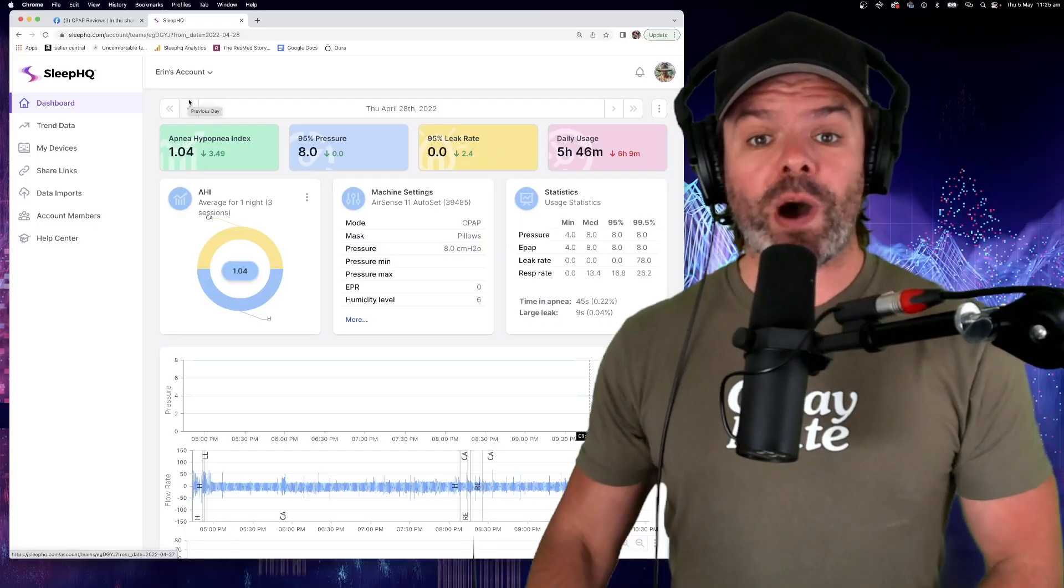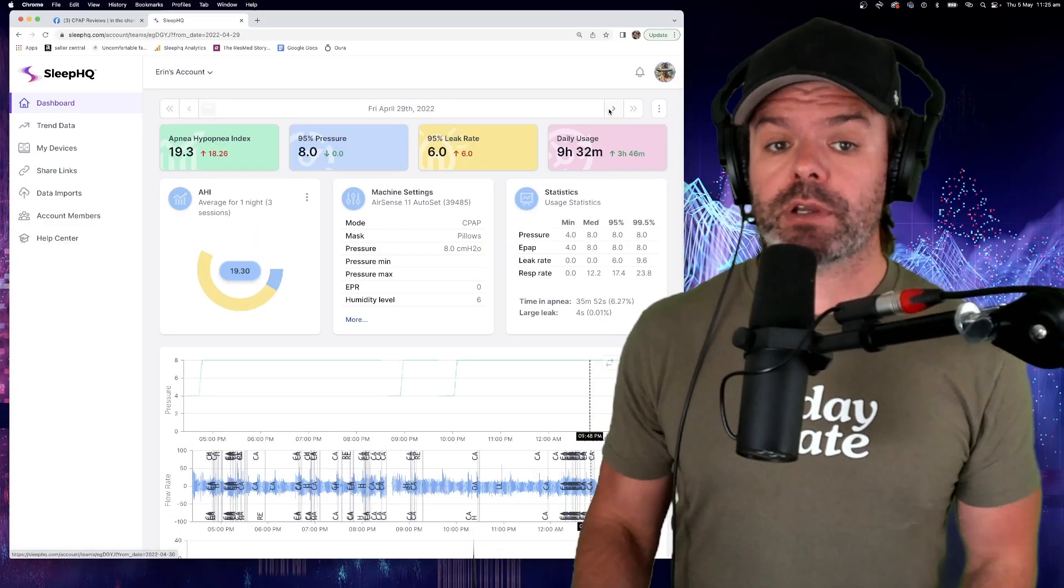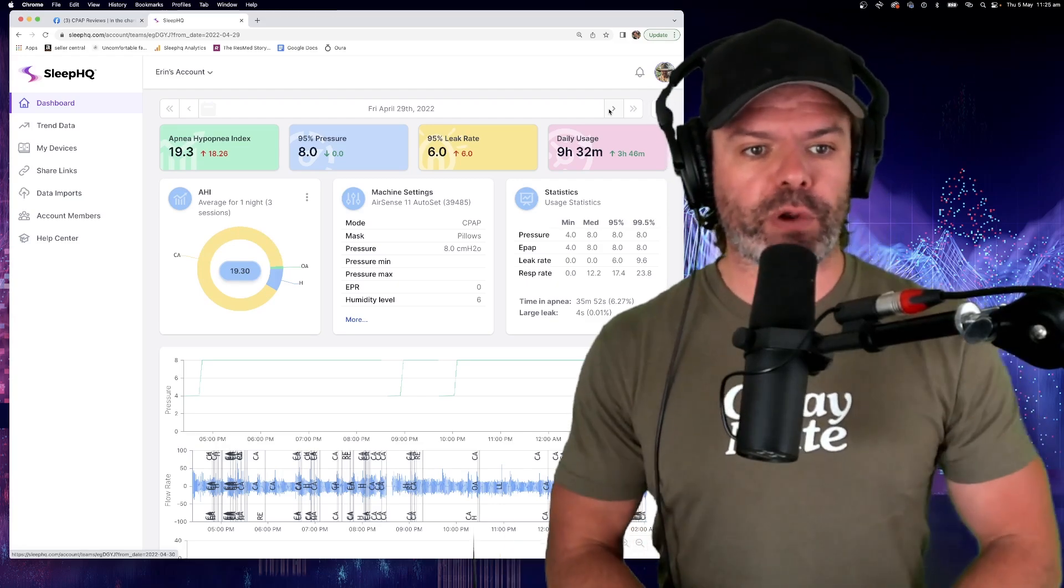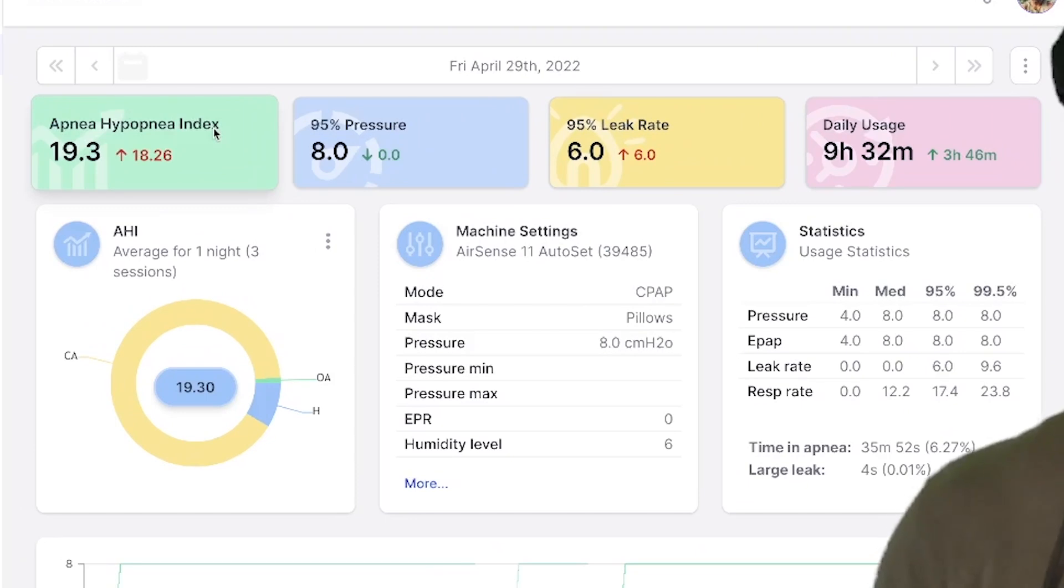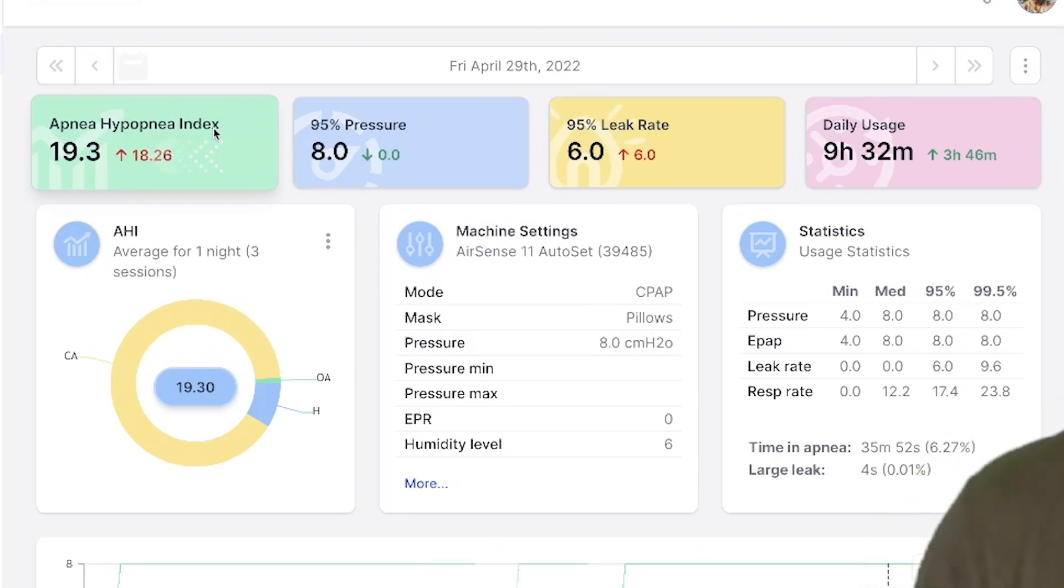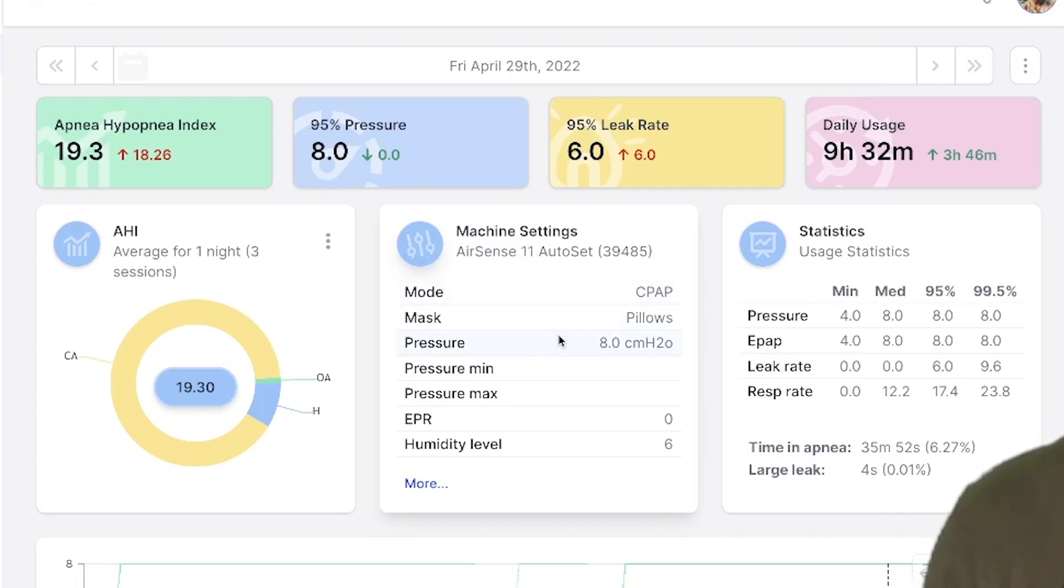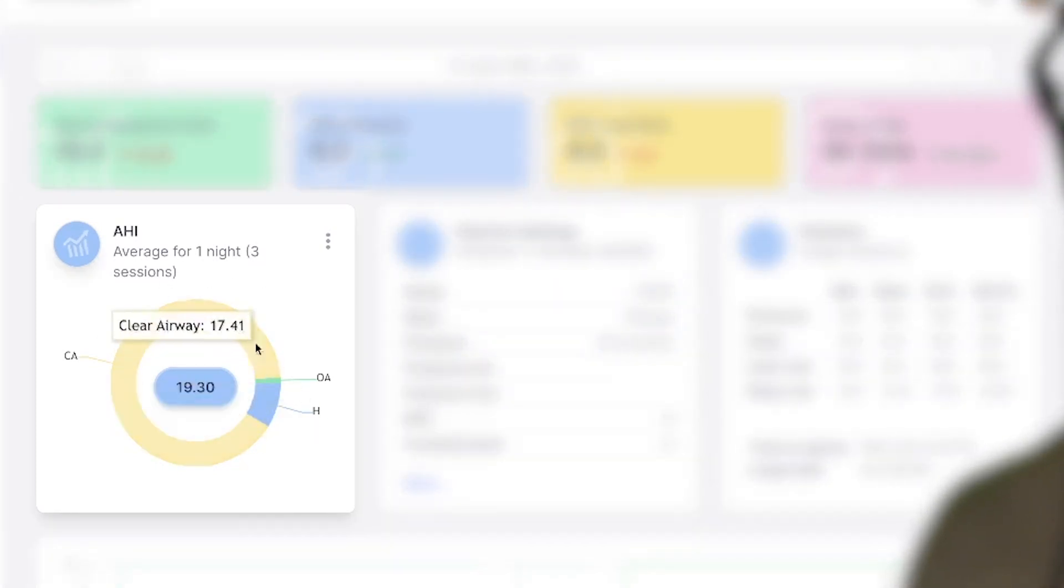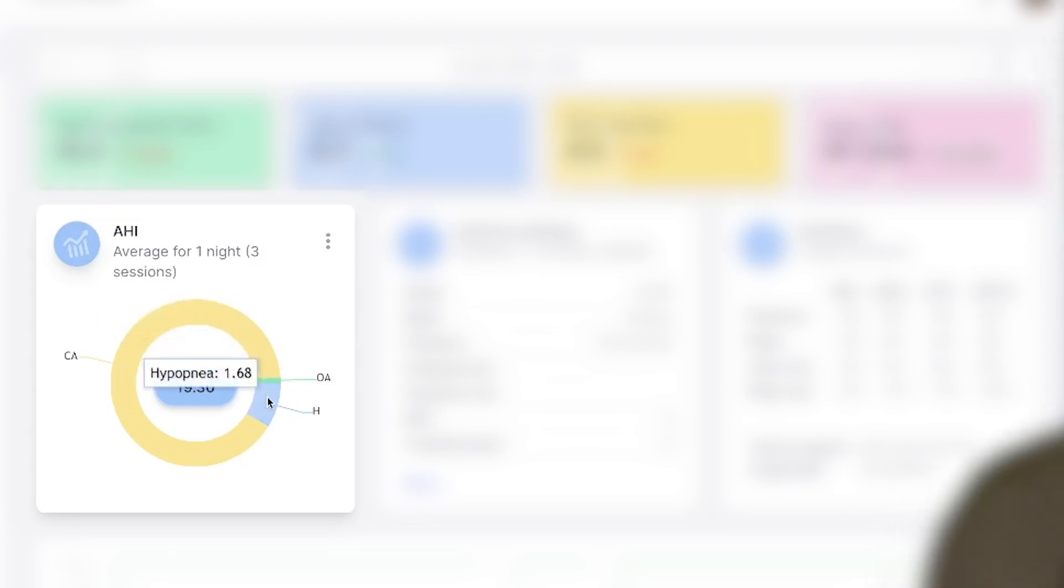All right, let's move forward one day to Friday, the 29th of April, because this is when things really started to unravel for poor old Erin. Have a look at this. Her apnea hypopnea index up a massive 18.26 to 19.3 from the prior day. And nothing's changed. Look at her machine settings, still on CPAP mode, still on a pressure of eight. Now, if we go over here to this little donut, we can see here the majority of that apnea hypopnea index, that 19.3 is made up of clear airway events, central apneas. All right, 17.41. There's only a little bit of hypopnea and a little bit of obstructive events happening that's making up that AHI.